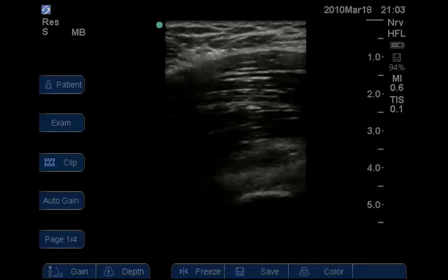And if you were to slide the probe further towards the head, you may also see bowel in this area here, bowel underneath the fibres of external oblique, but sitting on top of the fibres of iliopsoas, as iliopsoas dives posteriorly around the back of the pelvis. So again, in this clip, I've just got the patient to gently flex and relax the hip joint.